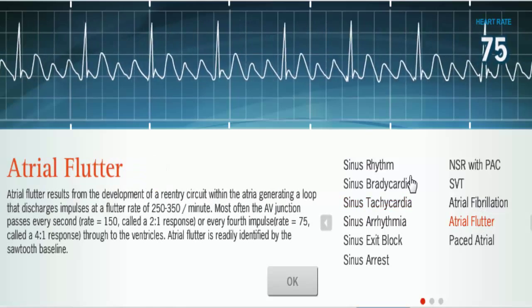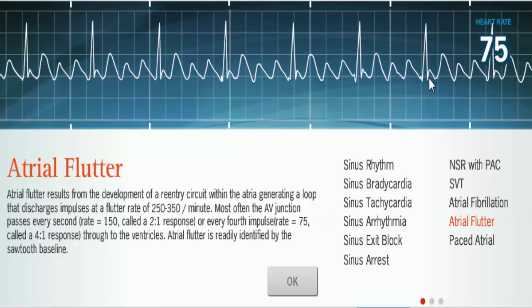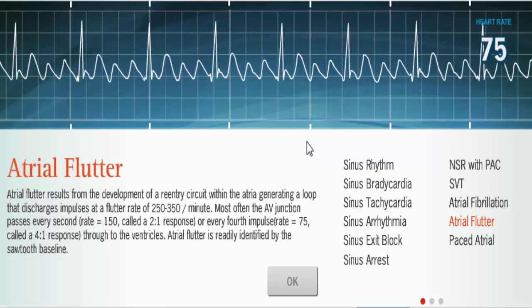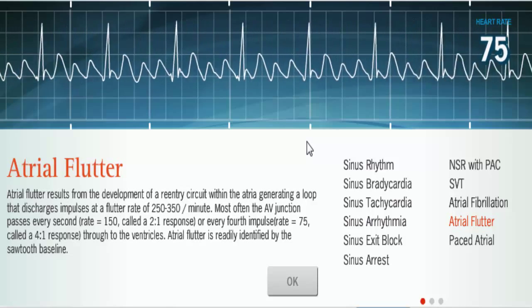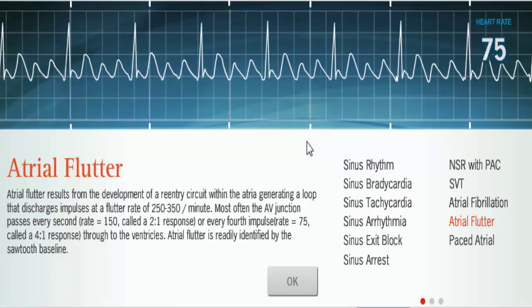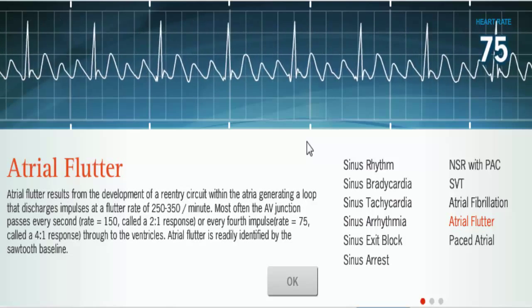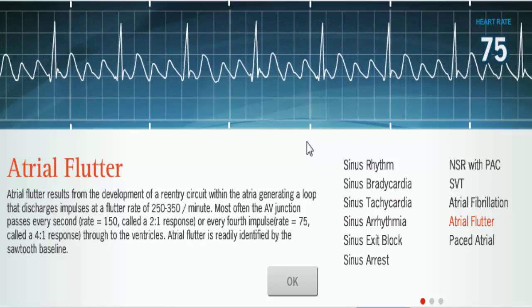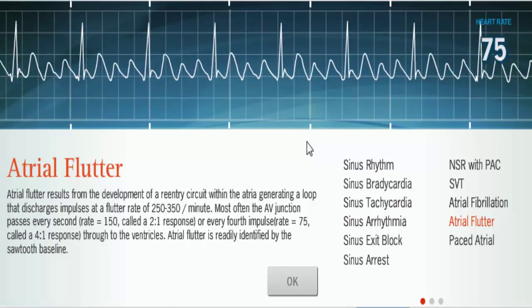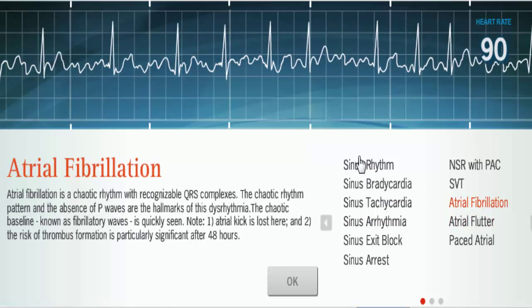Now let's do atrial flutter. With atrial flutter, you'll notice it looks like we have multiple P waves — these are called sawtooth waves. The atrial rate is 250 to 350 beats, a very fast atrial rate. What's happening is a reentry circuit in one specific area of the atria, so you have this continual beat originating from the same location in the atria.